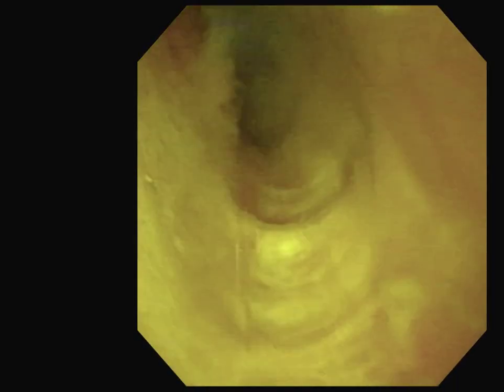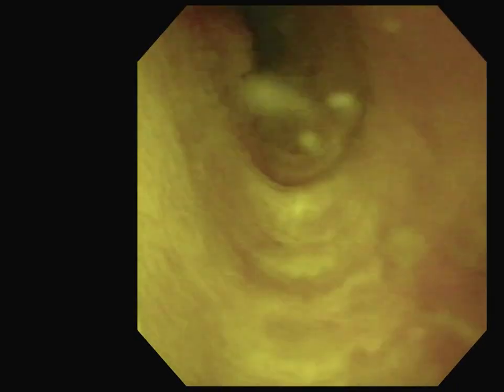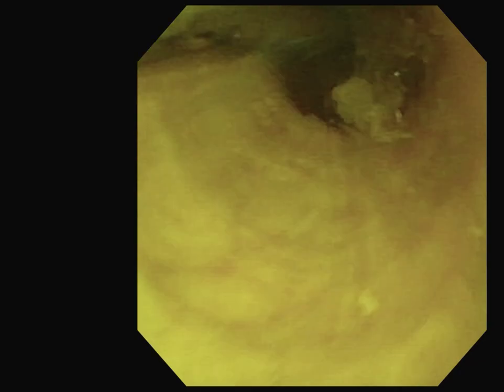A flexible ureteroscope was advanced down the drain tract into the gallbladder in situ. The stent at this time was noted to be filled with debris, and the solitary gallstone in the gallbladder fossa was identified. Laser lithotripsy was then performed using a Holmium laser with a 275 micron fiber.